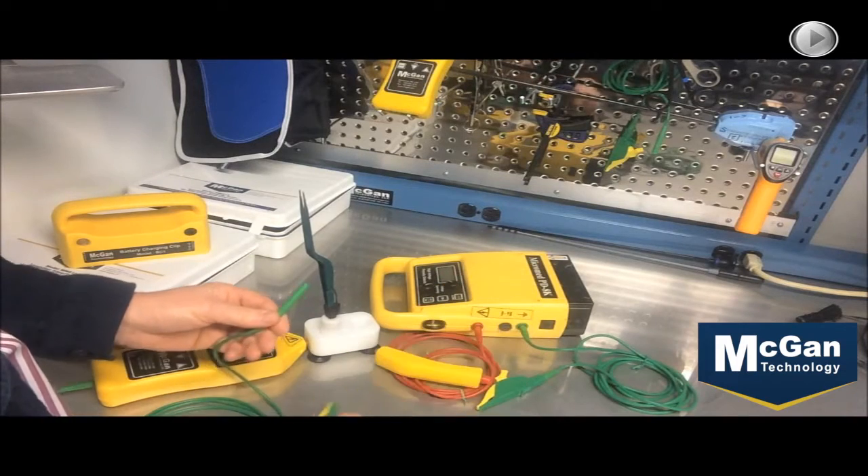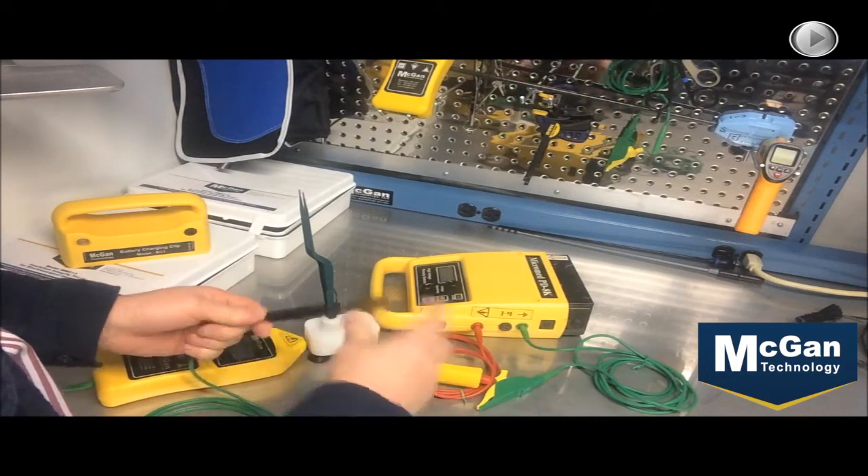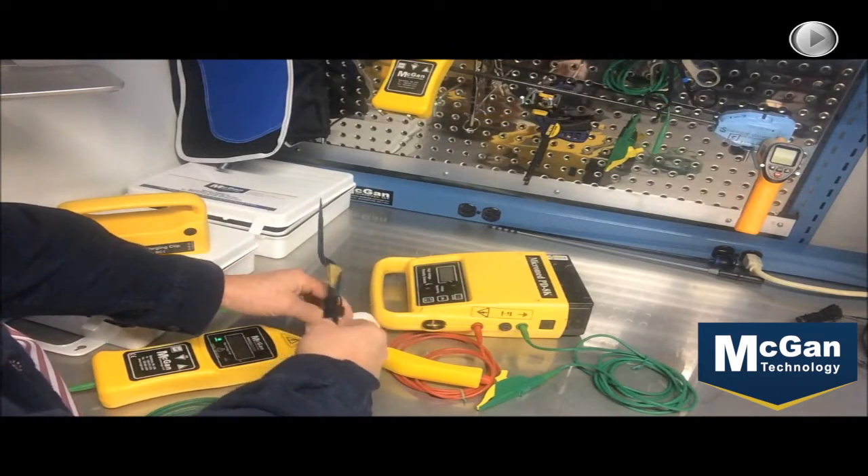We'll take the connector off the green wire, put the adapter on, insert the brush electrode, turn the unit on, and we're ready to test the instrument.